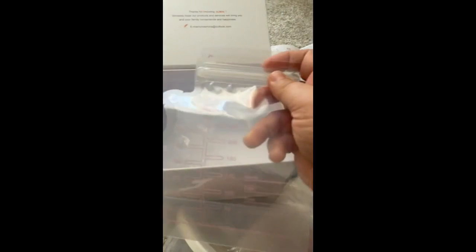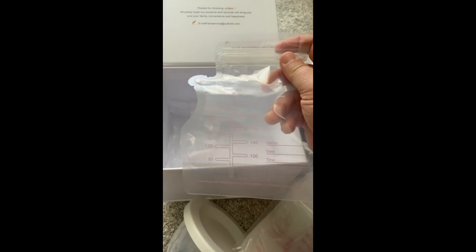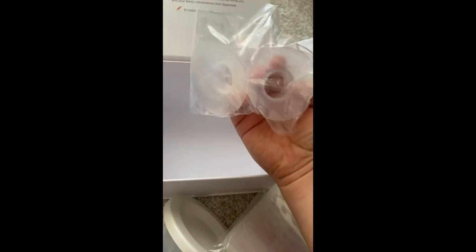And maybe they could add ounces on there. I mean, some moms like ounces and stuff, mLs. It's really preference. And then these are just the 22s.